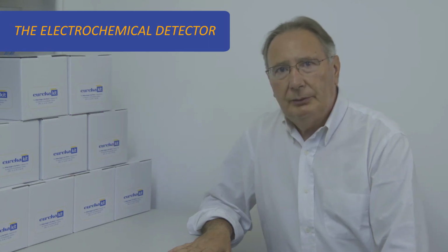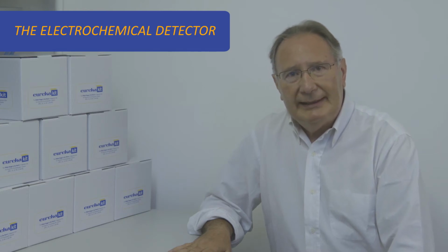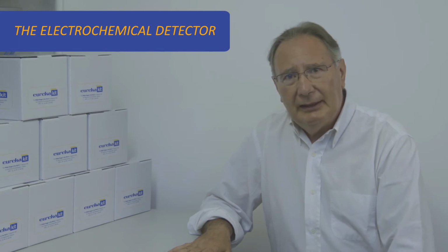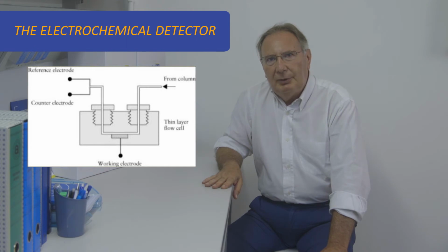These detectors are used in the detection of ionic or electrolyte solutions that are sensitive to oxidation or easily reduced. Therefore, these detectors are destructive in nature as the molecules passing through the detector are modified. The amperometric detector is the most common.